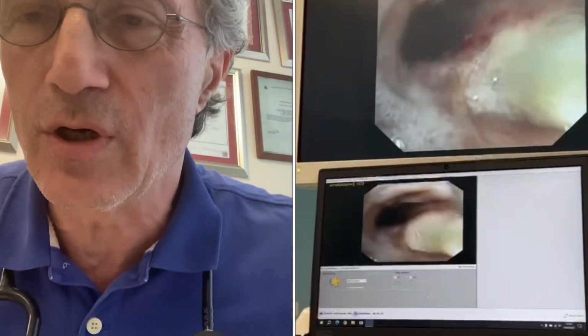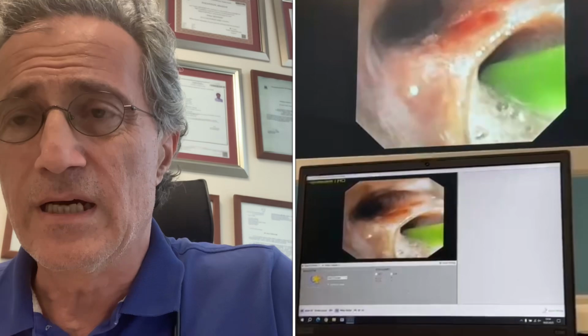The procedure can be performed on patients in stage 3 severe and stage 4 very severe, or in advanced stage 2 if they have significant complaints and desire for the treatment. Patients are checked for blood thinners, which must be stopped at least 5 days prior to the procedure.